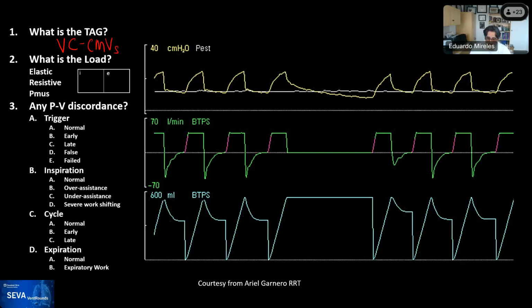So I see a series of people talking about elastic load. And then there's a question from Michael Smith, and he asks probably one of the crucial questions: is the load affected by the presence of a leak? Rob, do you want to comment on that?